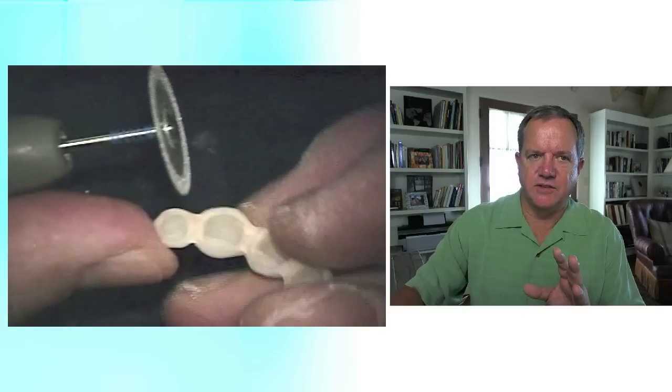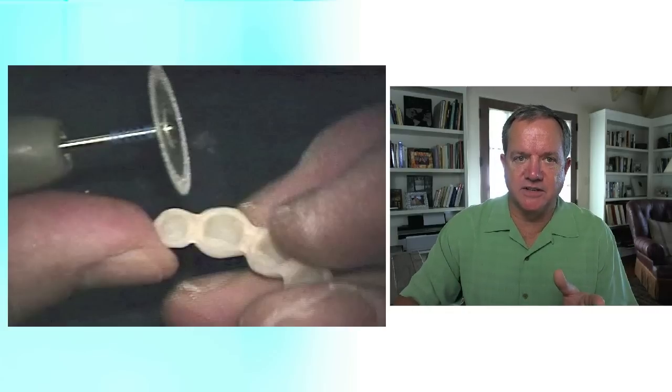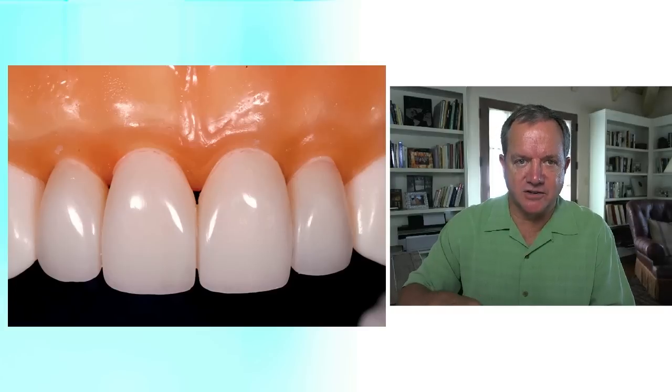Now if this was a veneer temporary, I would have used a finer grit burr. But for full crown temporaries, I use that big flame-shaped burr. And as you can see in the next step on the video — interproximal contours. This took care of facial and lingual contours. Just to show you how well that temporary fits: this is it put back on the deniform that we made the alginate impression of, and then made our Mach 2 silicone model and fabricated the temporary.